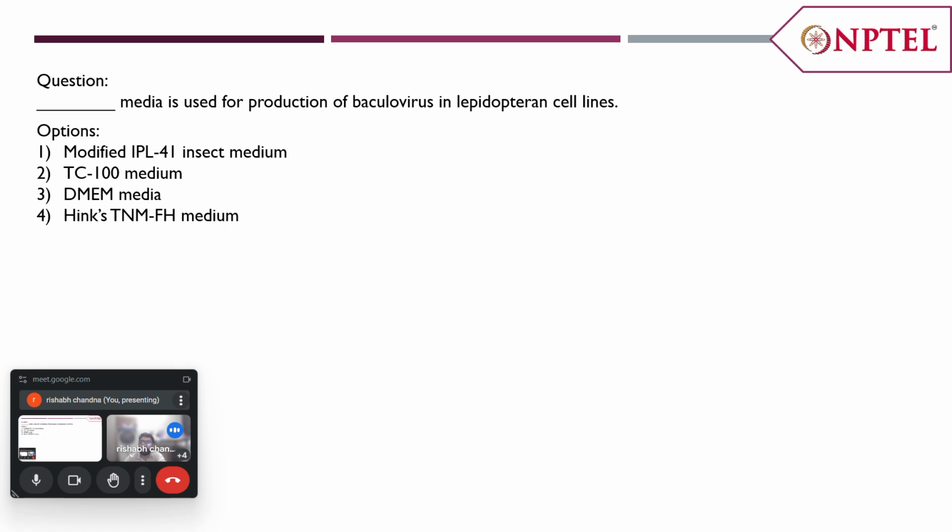But because we need the serum to grow the cells, because only the growth factors are not needed, right? It also has certain components like the proteins, the modified proteins also present, that help the cells to grow. So in that case, we use the heat inactivation process of the serum.